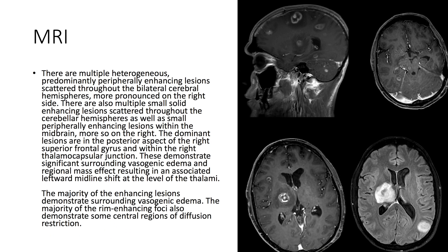On the MRI, we see multiple rim-enhancing lesions scattered throughout the bilateral cerebral hemispheres, more pronounced on the right side. We also see one here in the midbrain. The largest of the lesions are here in the frontal gyrus, as well as here in the right thalamocapsular junction. These demonstrate significant surrounding vasogenic edema and regional mass effect, resulting in an associated leftward midline shift at the level of the thalamus.